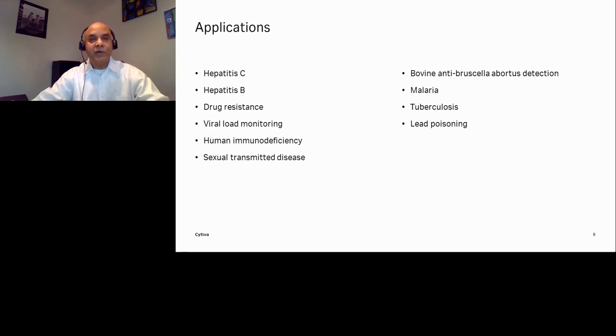Another example of surveillance was done for Toxoplasma gondii. Toxoplasma gondii is recognized to be a major cause of congenital infection, which may result in mental retardation. However, the prevalence of infection varies widely in European countries. A modified latex test costing very little per test has been used for extensive surveys to determine the maternal prevalence of antibodies. I should talk about detection of nucleic acid in DBS.